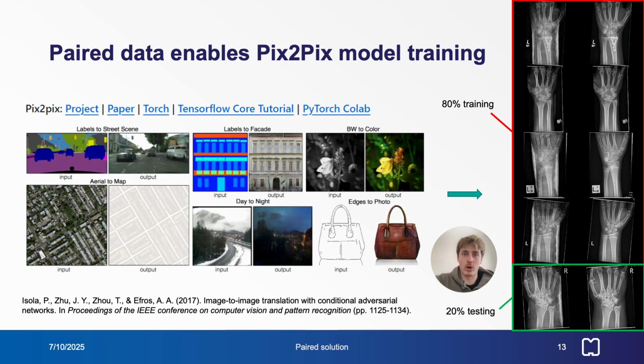Thanks to the CycleGAN model trained on unpaired data, we are able to train a model on paired data. So we split our data with an 80-20 ratio such that there were 8,000 pairs for training and 2,000 pairs for testing.